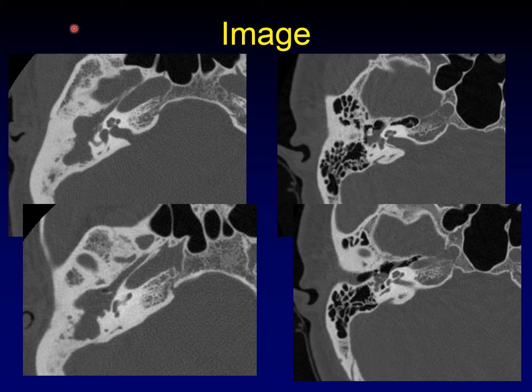Okay, let's talk it out. In patient number one, the mass fills the epitympanum. Look how few mastoid air cells there are — there is essentially just the antrum itself, the mastoid antrum. Also, look how wide the aditus ad antrum is. On patient number two, all of the mastoid air cells are preserved.